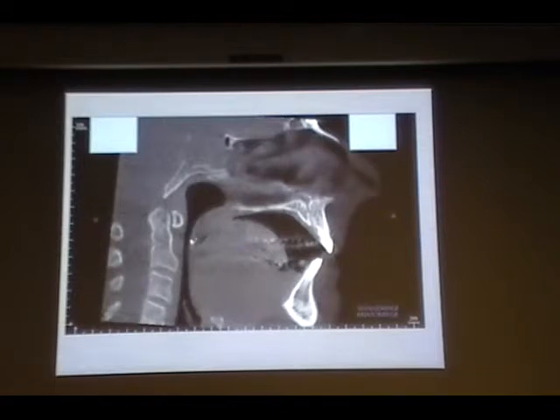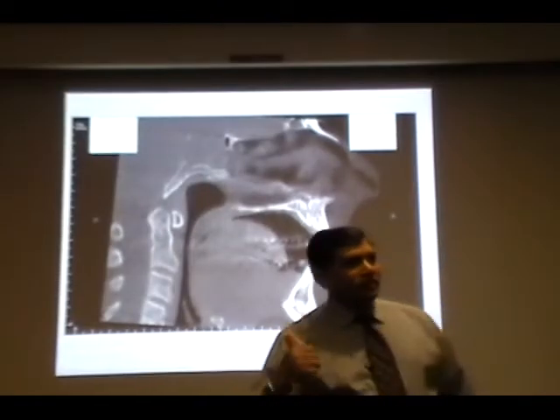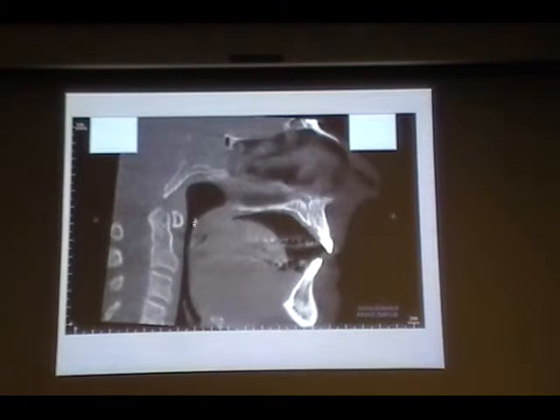So here, there should be at least 5 or more, maybe 10 millimeters of gap. If it's not there, that means this patient may have sleep apnea or could be a precursor for sleep apnea. The patient might be snoring during the night time. So how can I tell? Because there is a reduced airway space.